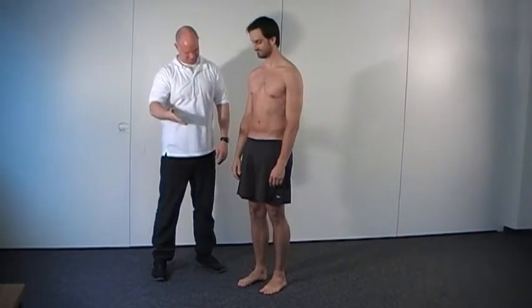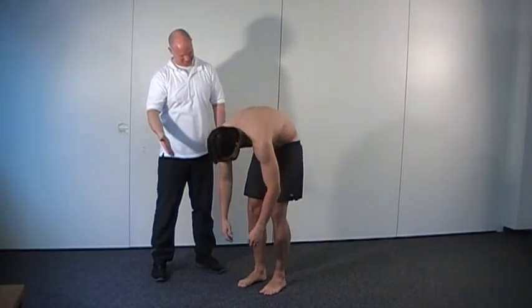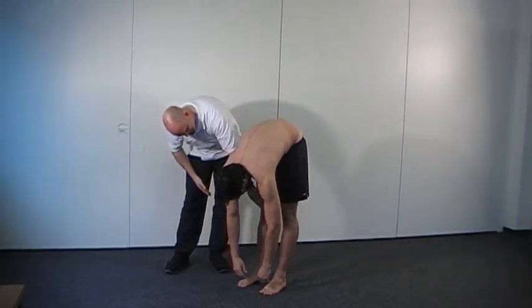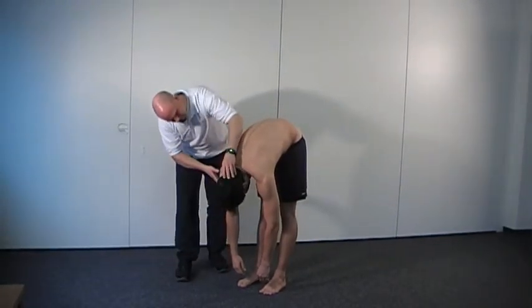Roll the body gently down from top to bottom. The upper body is bent forward and downward as far as possible. Knees remain straight. The head and arms are hanging down.